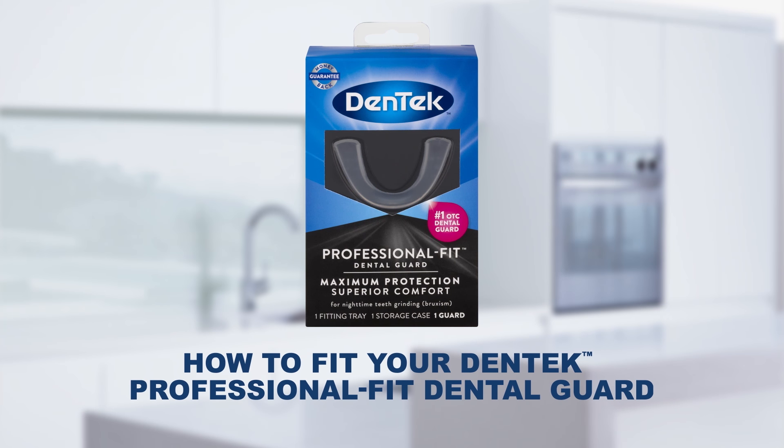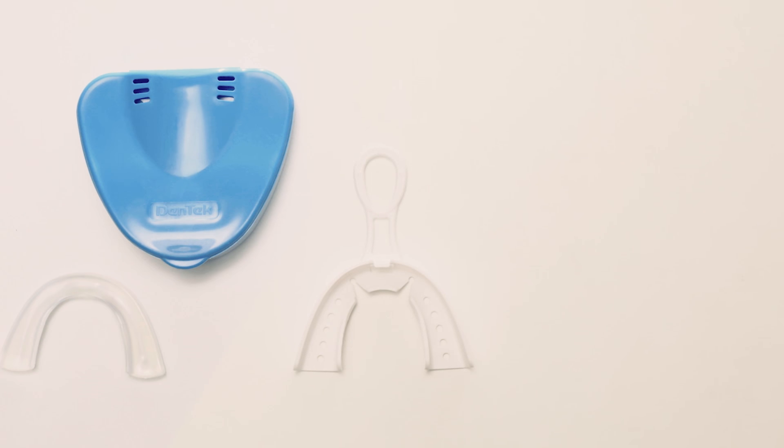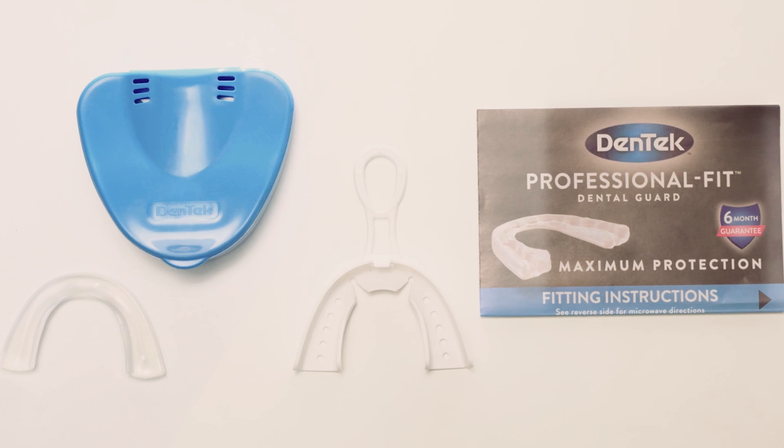How to fit your Dentec Professional Fit Dental Guard. This video will show you how quick and easy it is to get a professional fit in just a few simple steps. First, read all the instructions and warnings and watch the full video before you begin to fit your guard.